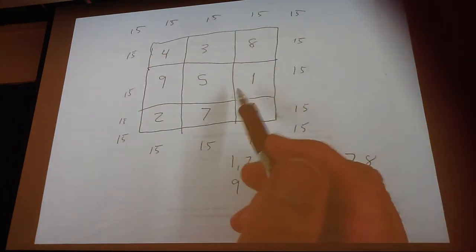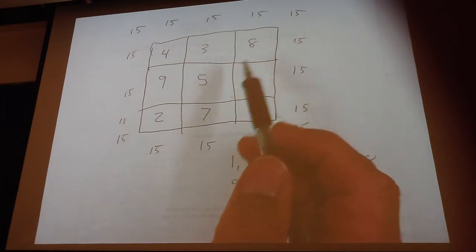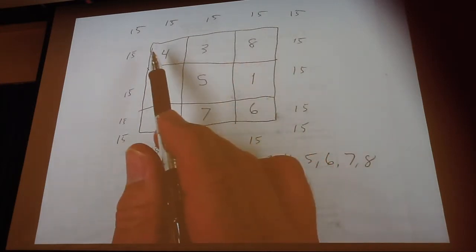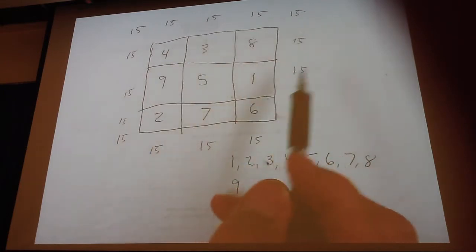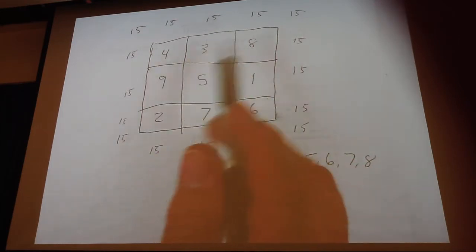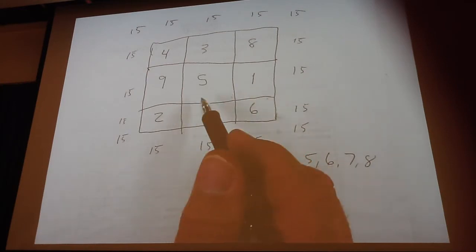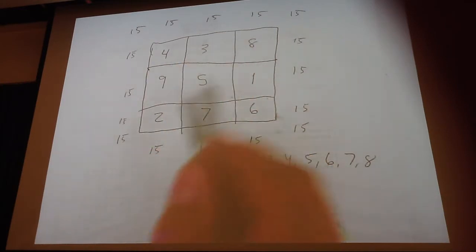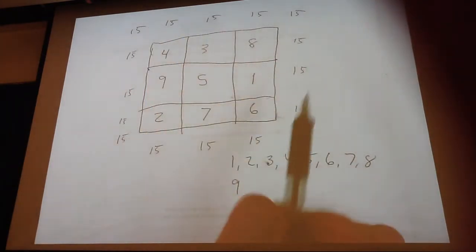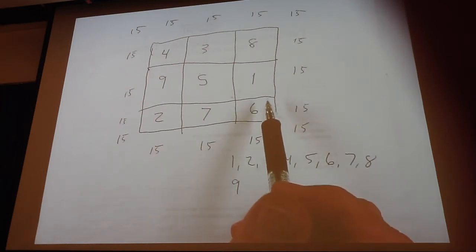Now, just imagine if you had 16,000 of those to guess. Each time you make a guess, that's one iteration. So let's say you put the numbers in here and you found out that they didn't add up properly. That would be one attempt. Then the computer, if it does find areas where it does add up to 15, will leave that there, and then it will try a second attempt. It keeps on trying and putting numbers in boxes until things get as close to 15 as possible.